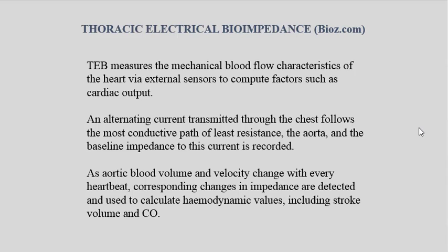So having measured the resting impedance, the resting resistance, think as the aortic blood volume and velocity change with every heartbeat, there are corresponding changes in impedance, and these are detected and used to calculate various hemodynamic values, including stroke volume and cardiac output. Very clever little device, again, highly dependent on available technology. And again, we had this one in our lab. The ones we haven't had are those for intubated patients.